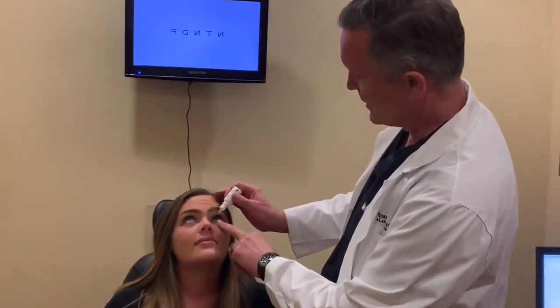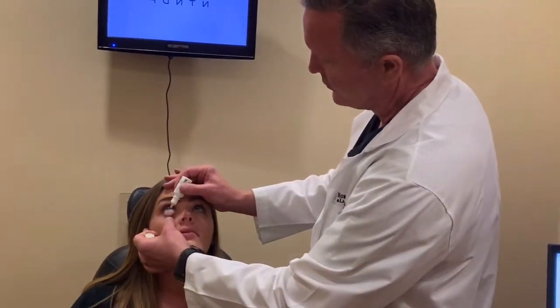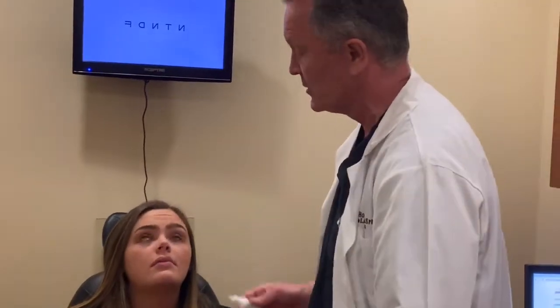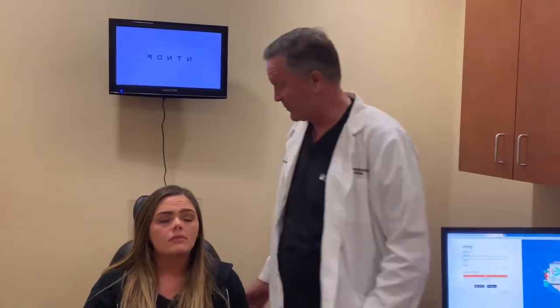Brooklyn, just look up for me. I'm putting a little proparacaine drop in — I like pulling the lower lid down, put a little drop, and then asking the patient to blink that around. Second, it's always easier if we tilt the patient back.